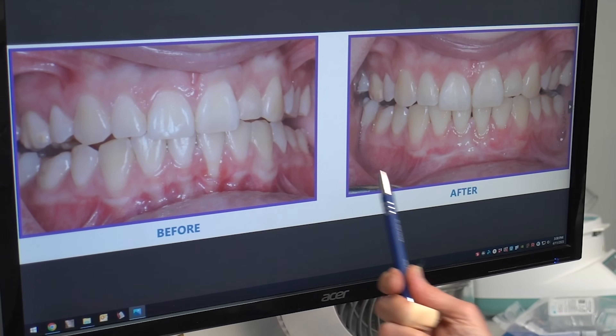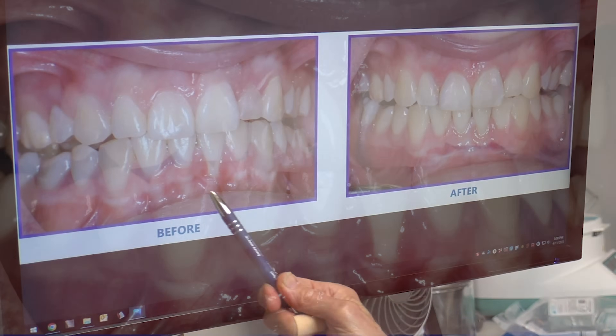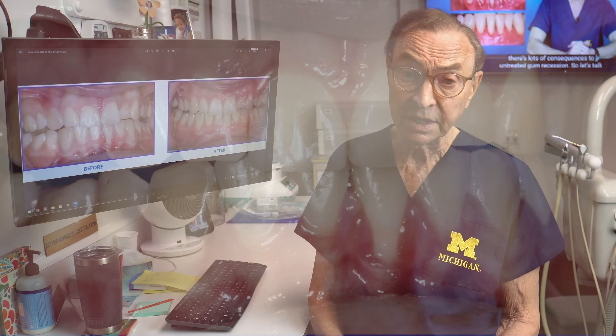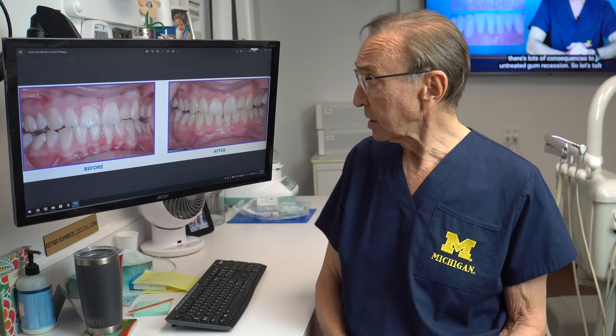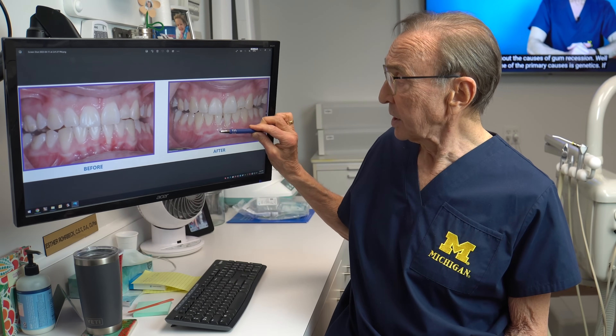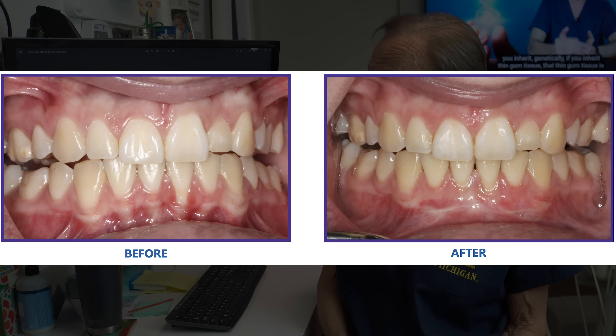And this is another case — some of these are very tricky. This area here was very sensitive and bled very easily. And these lower anteriors are probably the most difficult area in the mouth to get adequate coverage. But we were able to bring that tissue up and cover that root almost completely. The bleeding stopped, it was much more comfortable, and now we have a good prognosis for a tooth that we didn't have a good outlook for before.